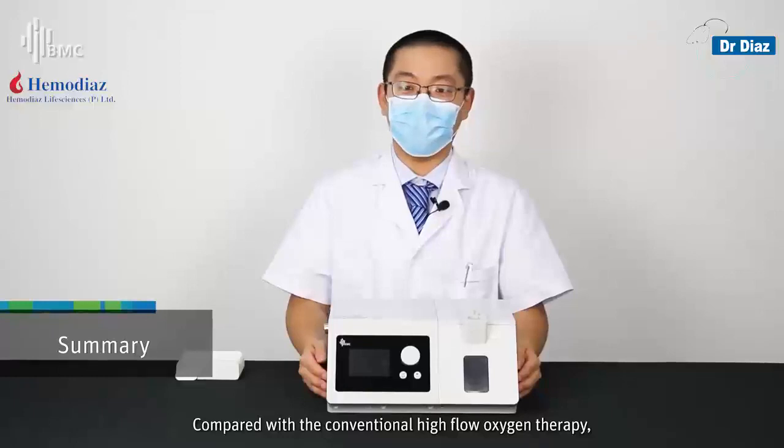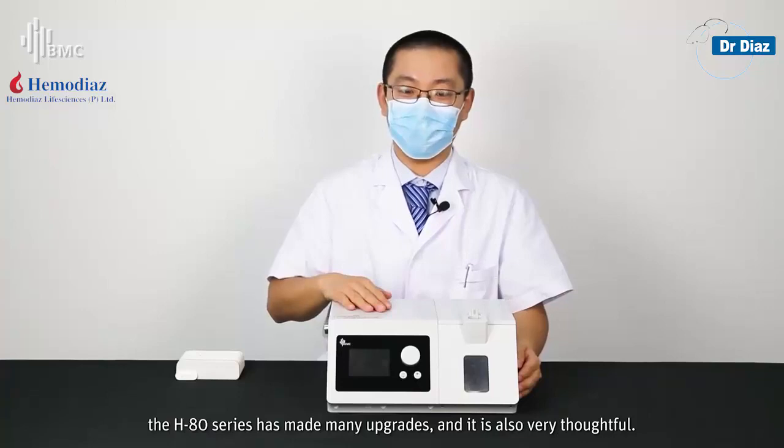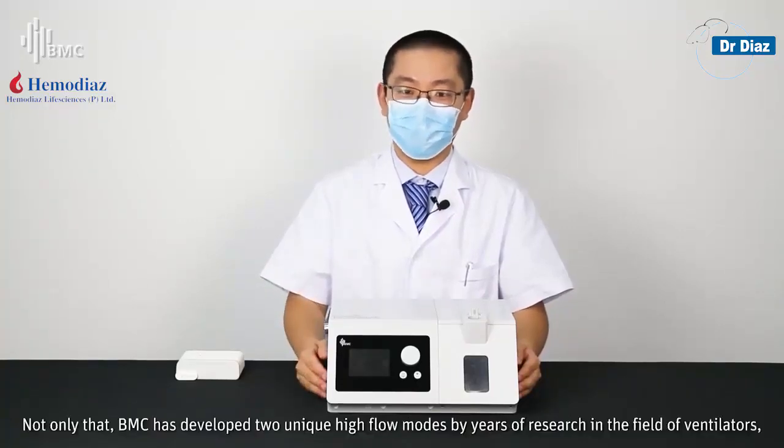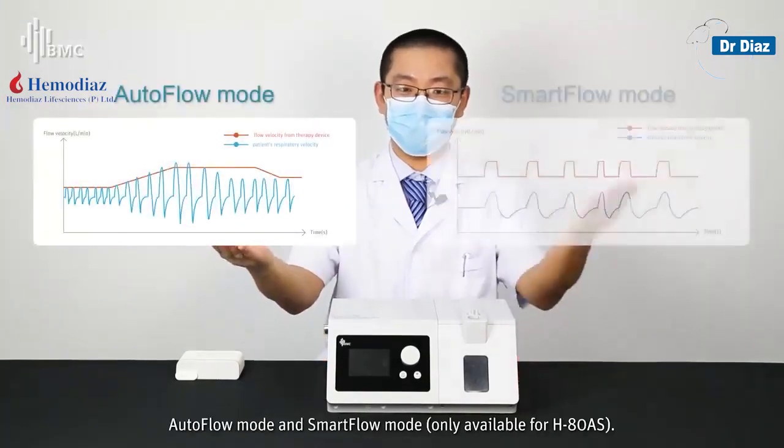Compared with conventional high-flow oxygen therapy, the H-80 series has made many upgrades and is very thoughtful in its design. Additionally, BMC has developed two unique high-flow modes through years of research in the field of ventilators: Auto Flow Mode and Smart Flow Mode.